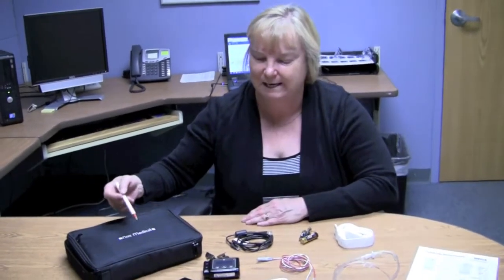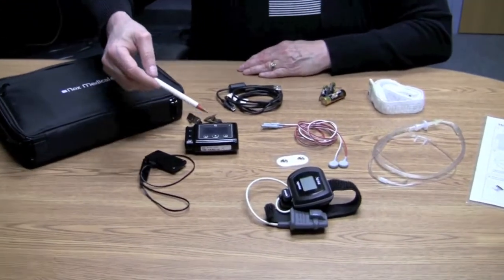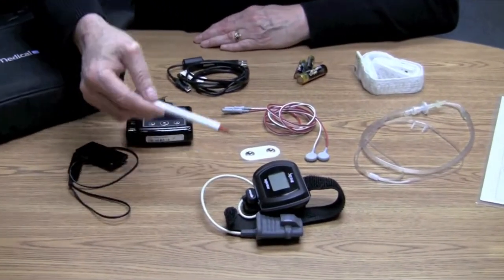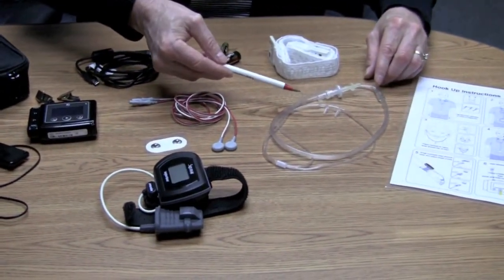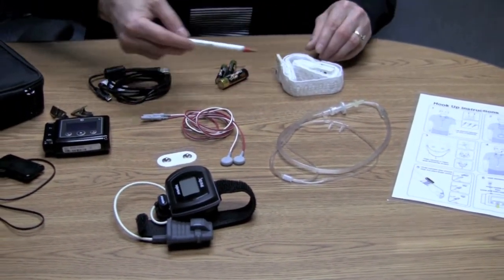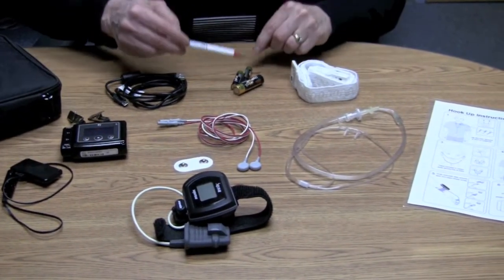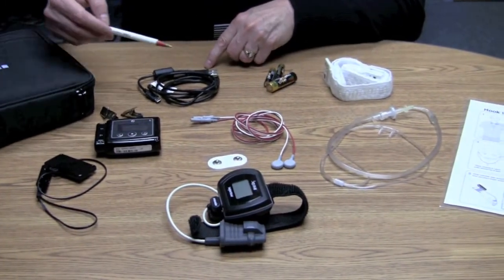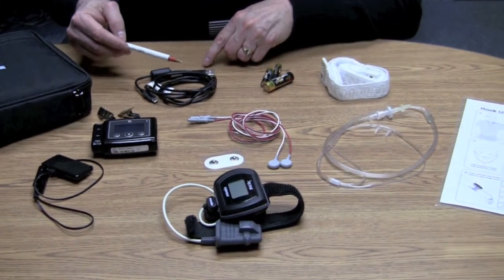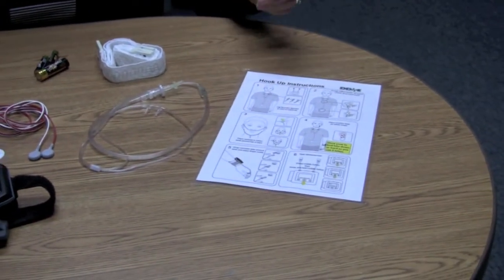What's included in your case is the monitor for the home sleep test, the pulse oximeter, the bruxism leads, the cannula for breathing, two belts that will connect with your monitor and hold it on while you're sleeping, batteries, and the USB cable for connecting the monitor to the computer software, as well as easy-to-reference instructions for when you're meeting with the patient.